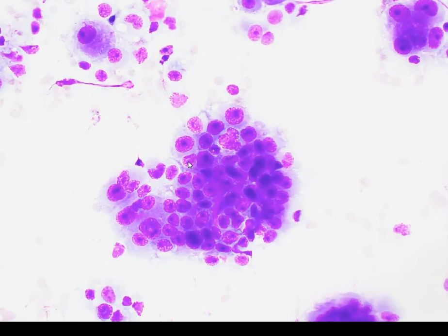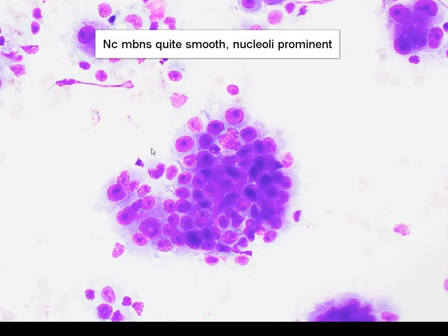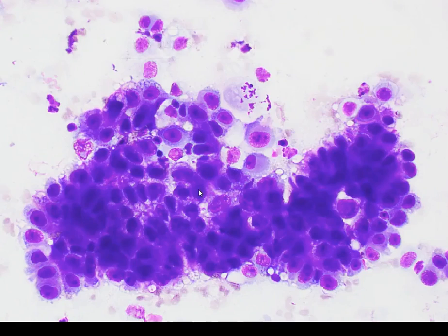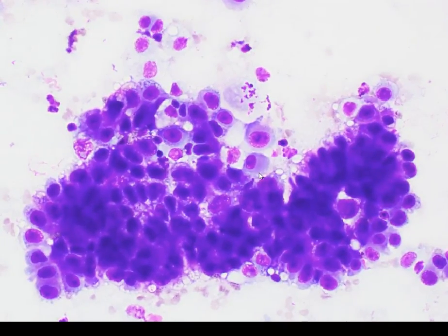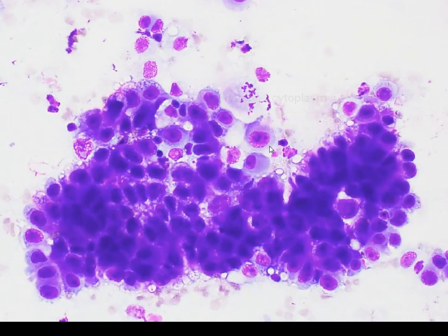In this high-power view, we can appreciate that the nuclei are fairly central, meaning that they are not really abutting the edge of the cell. We can see quite rounded, relatively smooth nuclear membranes with very prominent nucleoli. The cytoplasm is quite delicate in some areas, and in other areas it appears a little bit more dense. Here for example in this cell, we can appreciate that there is a bit of a two-tone cytoplasm.